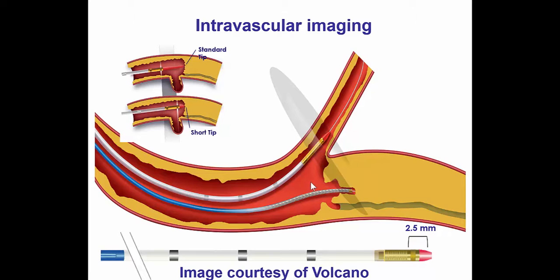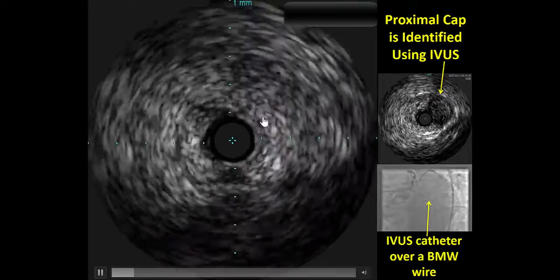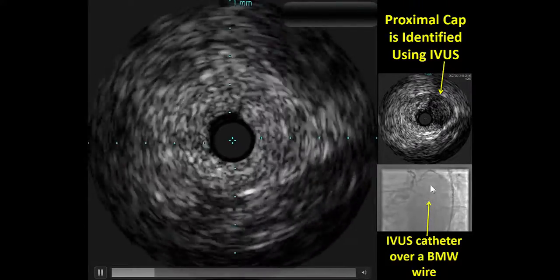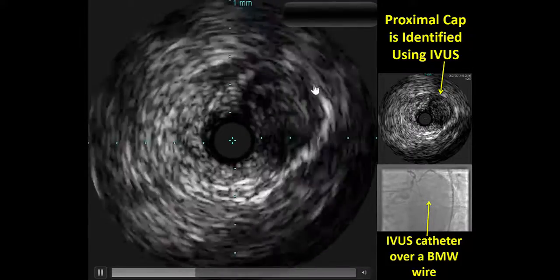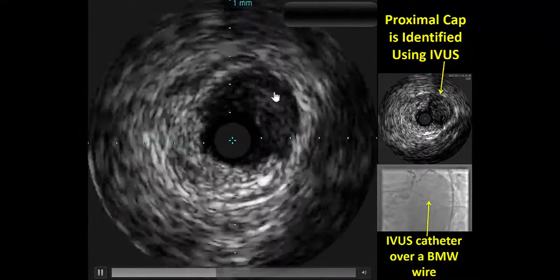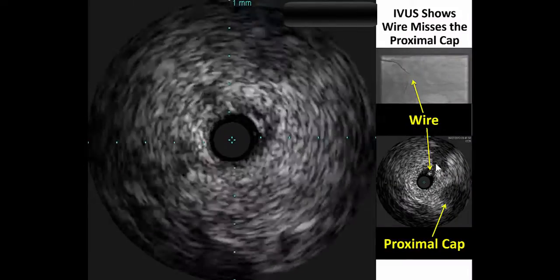In this case, when we have a bifurcation at the proximal cap, using intravascular ultrasound into the side branch can help clarify where exactly the proximal cap is and help us confirm that the guide wire is entering the proximal cap. This is the intravascular ultrasound — we're in the distal circumflex and slowly pulling back, and this is the occluded vessel that is slowly coming into view, clarifying where we're starting.